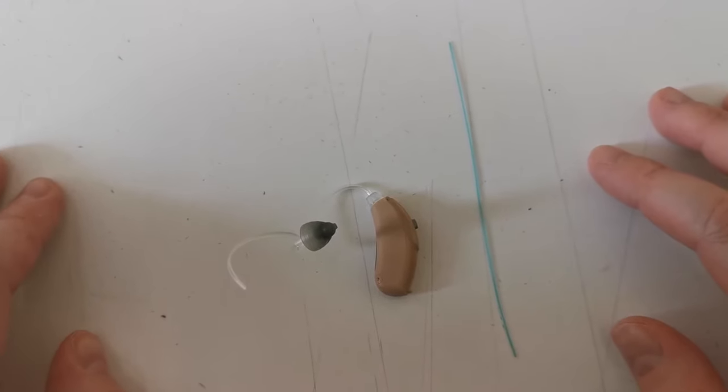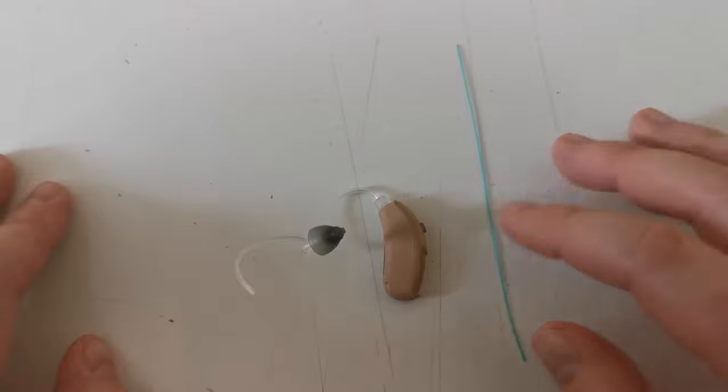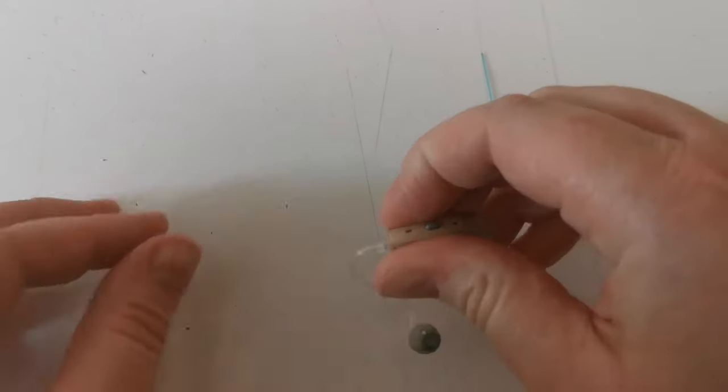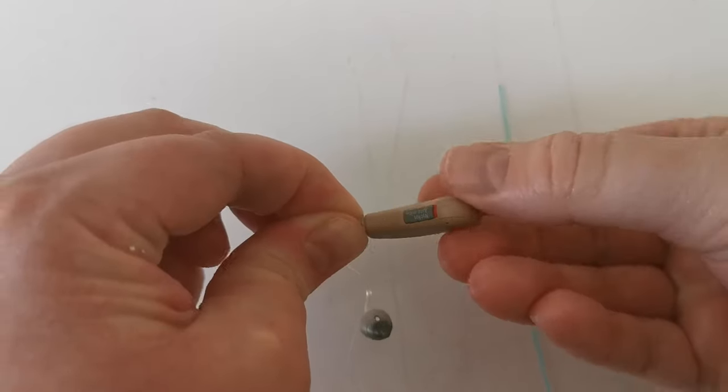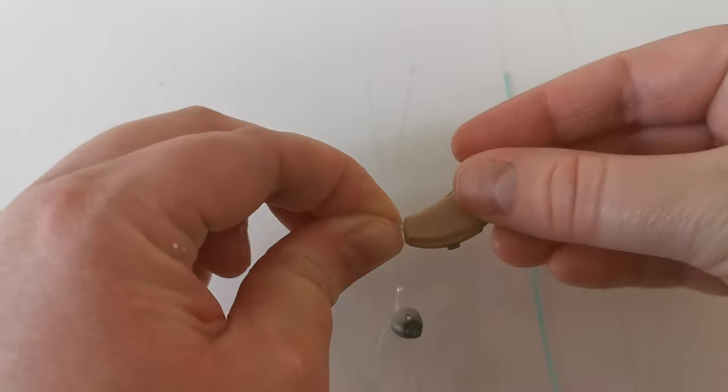In this video we will show you how to clean the hearing aid. To clean the hearing aid you unscrew the tubing from the hearing aid by turning it anti clockwise.